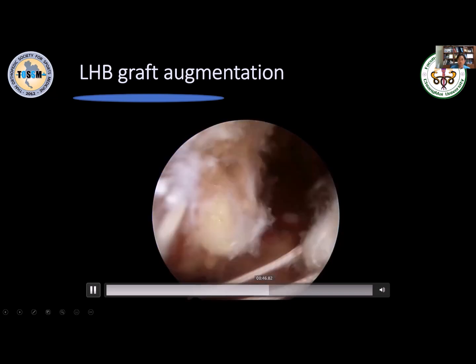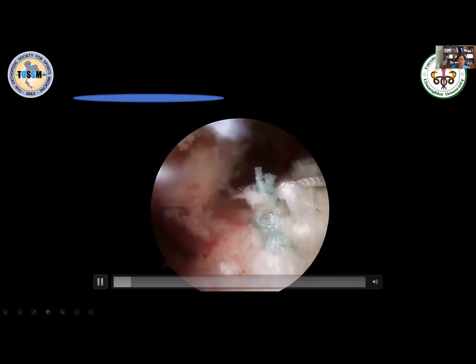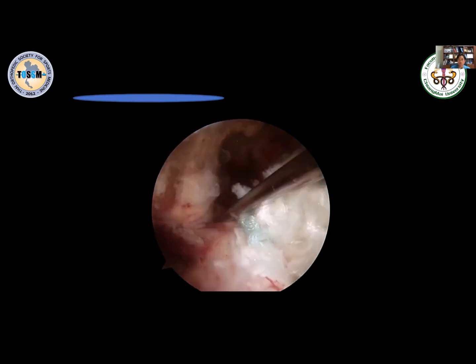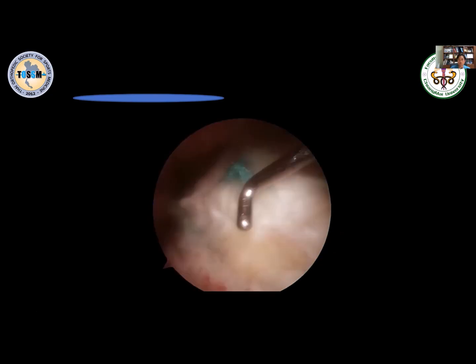Like that, stitch. So this is the end result. After I graft the bicep to the defect, we have a complete coverage of the humeral head. You can't really see the humeral head anymore. Right there, and this is the whole thing.